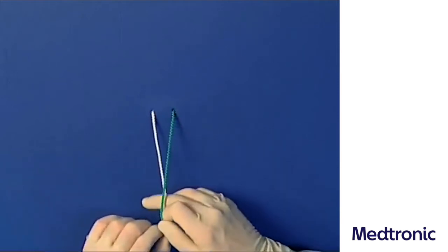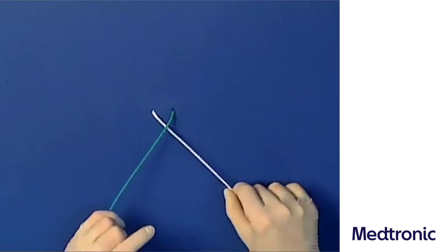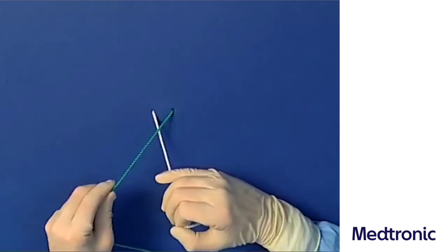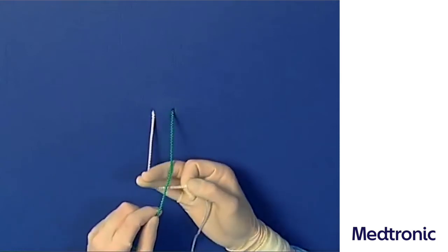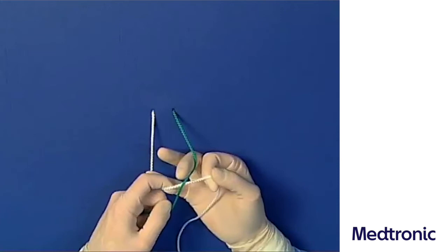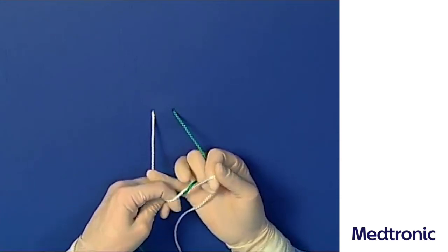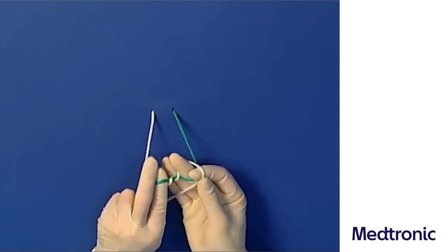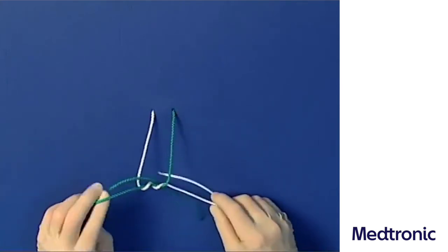After under-crossing, the left suture end is pulled through underneath the right suture end in the usual way by using the last joint of the right middle finger. Simultaneously, the end phalanx of the left index finger pulls the right suture part through under the left half of the suture. This produces the double winding as the first loop of the surgeon's knot.